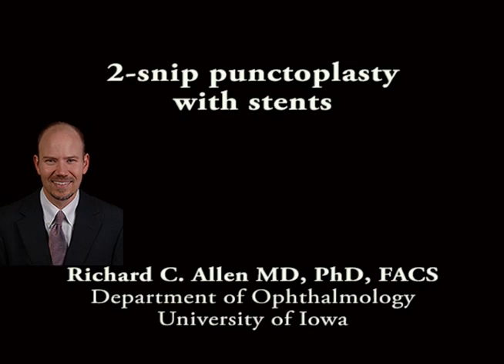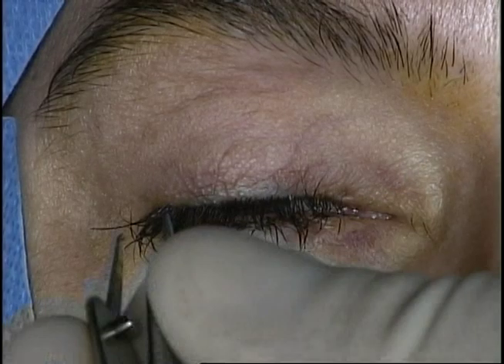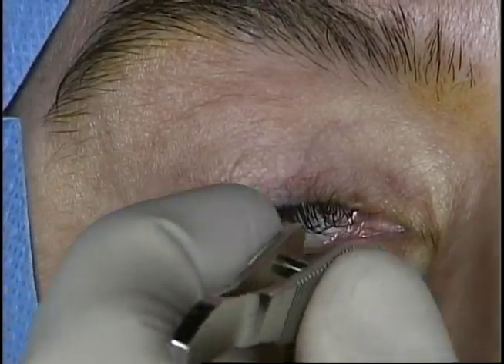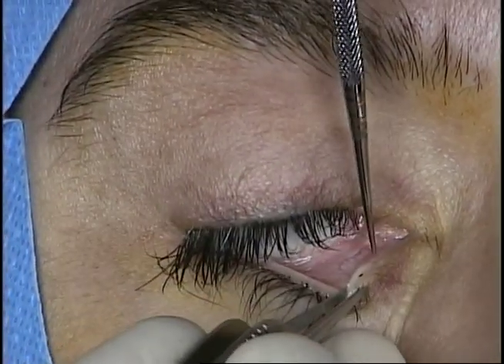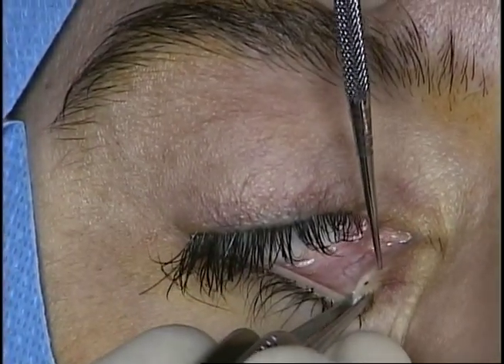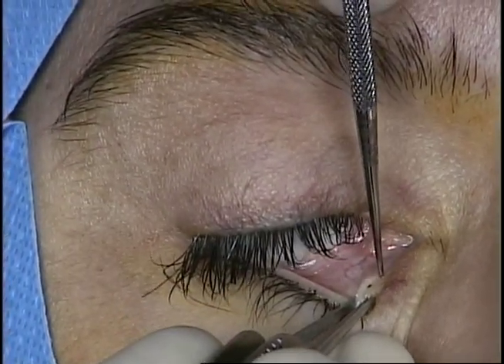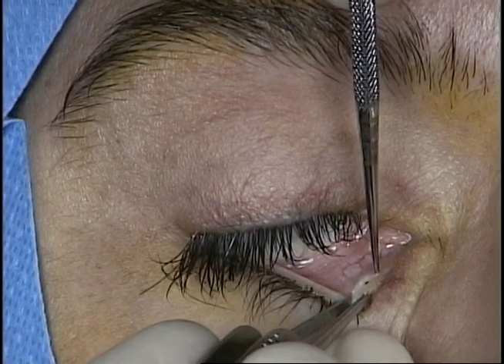This is Richard Allen at the University of Iowa. This video demonstrates a two-snip punctoplasty with placement of Crawford stents. The patient has a history of punctal stenosis.